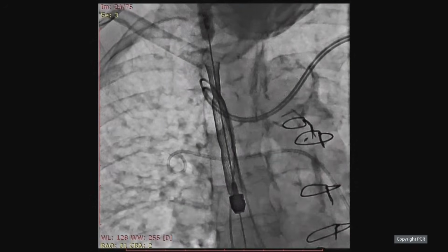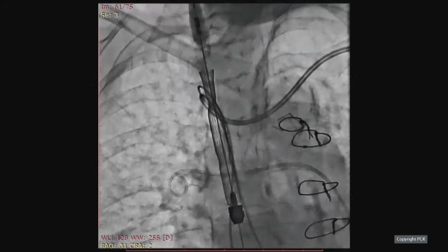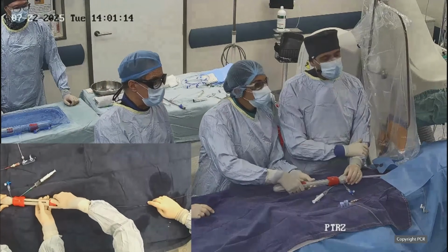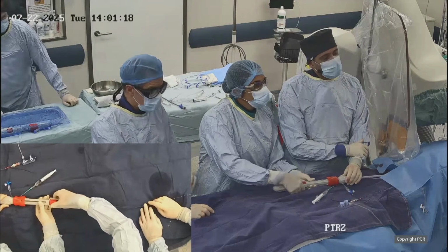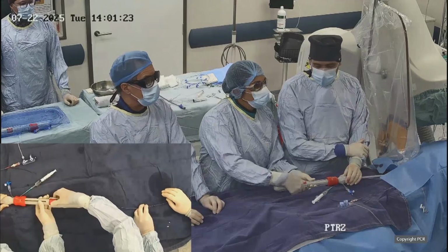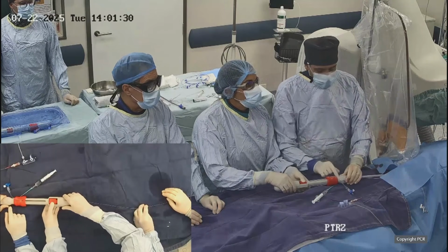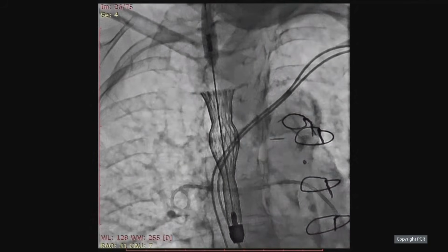So we're going to start releasing the system by scrolling. It's a long way, so we have to be patient. It's not for anxious people. And you're going to see that I am holding the system while Luciana is unscrolling the system, and also I am putting it back, because while you are unscrolling, the system is releasing and going in.